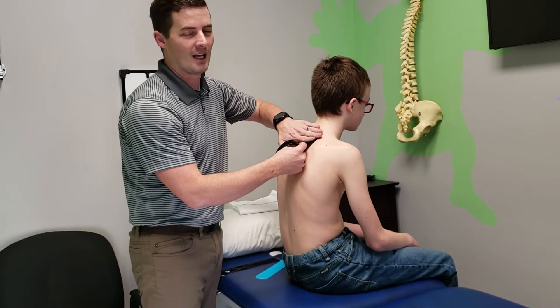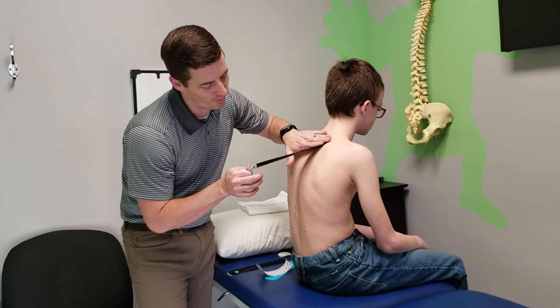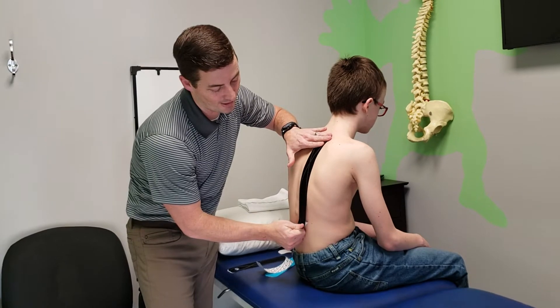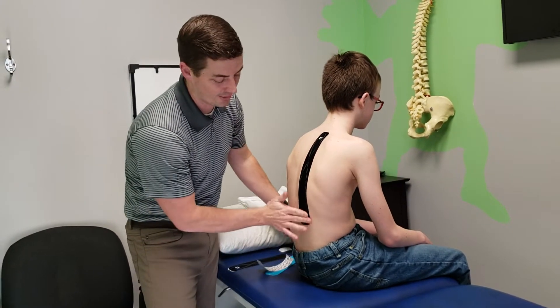I'm going to put the end of the piece of tape here, then I'm going to pull almost all the slack out of the tape, lay it down, and no tension on the end of the tape.